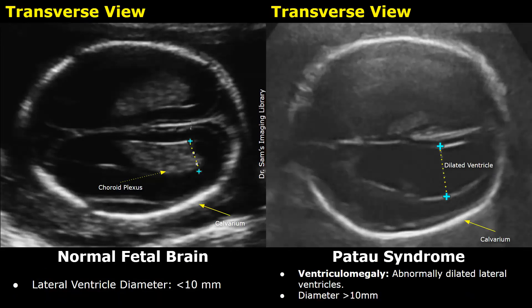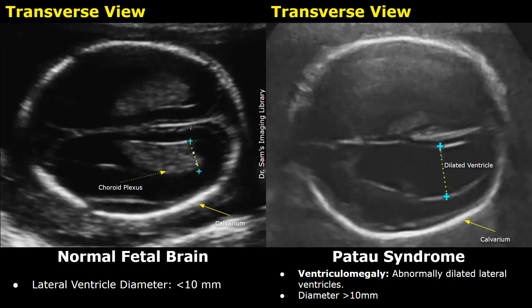Some ultrasound features indicate Patau Syndrome. The most common abnormalities include brain and facial abnormalities. Ventriculomegaly refers to abnormally dilated lateral ventricles. When the diameter of the lateral ventricle exceeds 10 mm, it is enlarged. The normal lateral ventricle diameter is less than 10 mm. An isolated ventriculomegaly does not really indicate Patau Syndrome, but if ventriculomegaly is present with other pathologies such as heart defects including ventricular septal defect or truncus arteriosus, and limb abnormalities such as polydactyly, or with kidney defects as well as facial abnormalities, it may indicate Patau Syndrome.